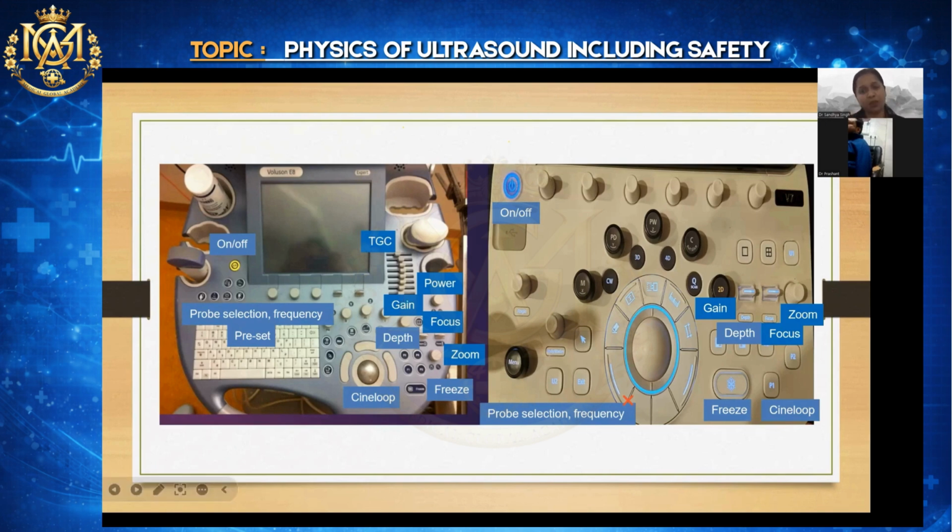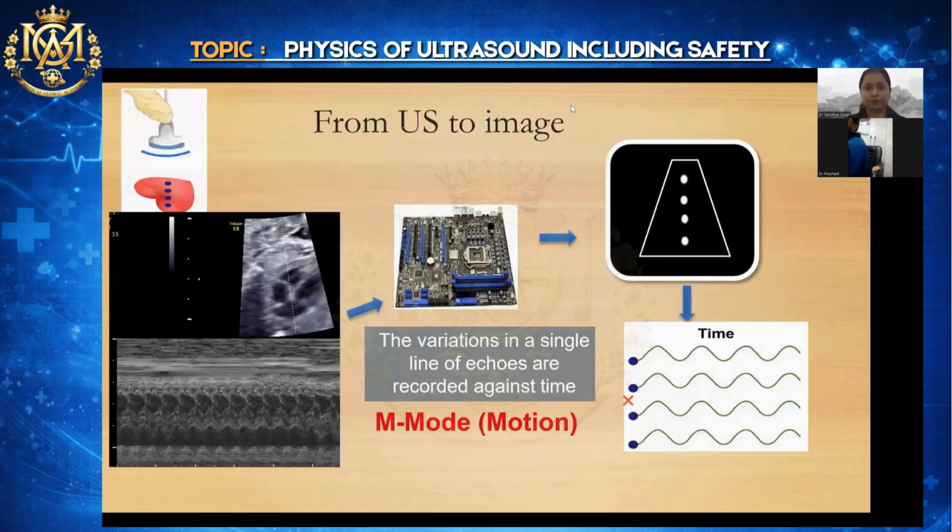What each button means and how to change it, I have a live video and live class for that. Maybe next class we can go for that, because knobology is a 1 hour lecture. So today we are just going to stick to the basics of physics, and that is why we are focusing on that. But I want to show you that these buttons are your car's equipment, I told you, no? आपको पता होना है कि कौन सा ब्रेक का वायर है, कौन सा एक्सेलरेटर का वायर है, क्या पानी कम हो गया, so many things, no? Similarly, if you know how to play with these knobs, you are going to be master in your field.